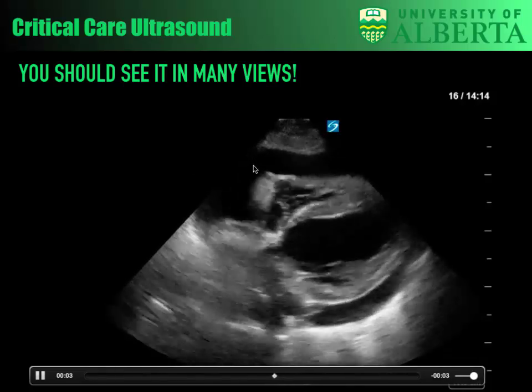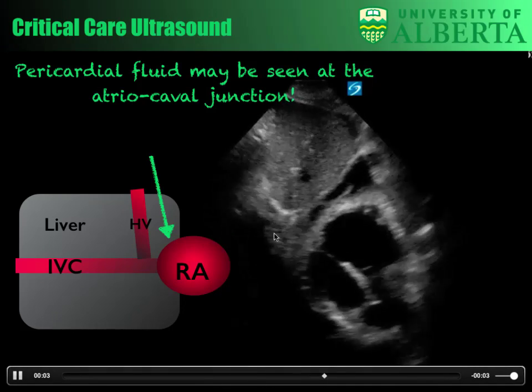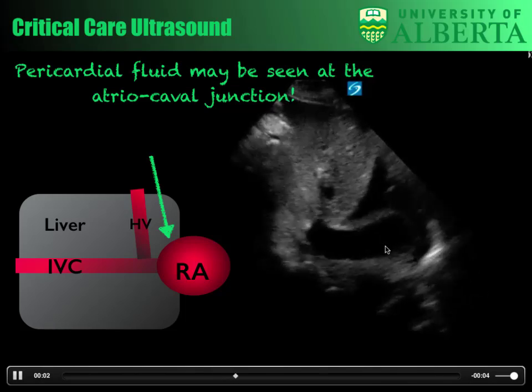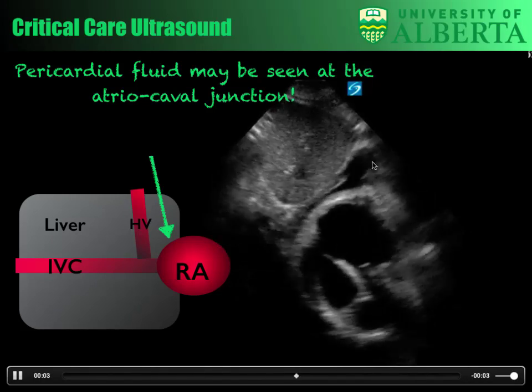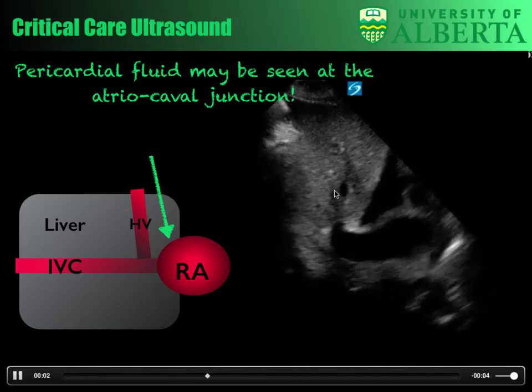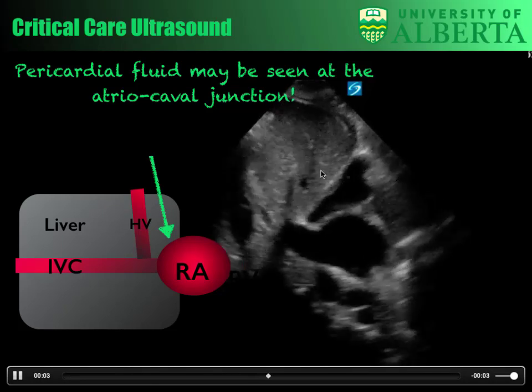So this is a subcostal view. We'll talk about the physiology here in a bit. The next thing is when we look at the IVC, for example. This is the IVC coming inwards, and this would be the hepatic vein, coming in out of view there, but this is into the right atrium. What we're seeing here is again separation of the right atrium from the pericardial space. When you look at the IVC, you may see this anomaly at the atrial caval junction, where you'll see fluid initially.